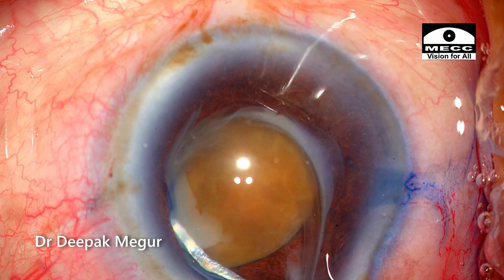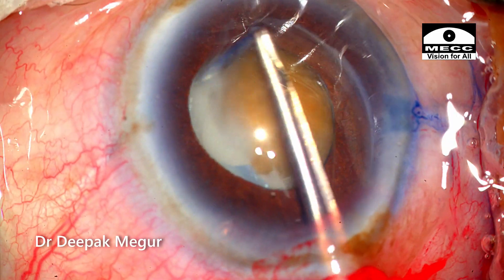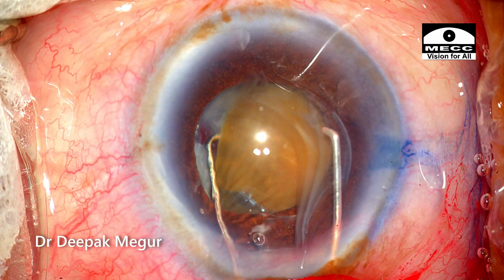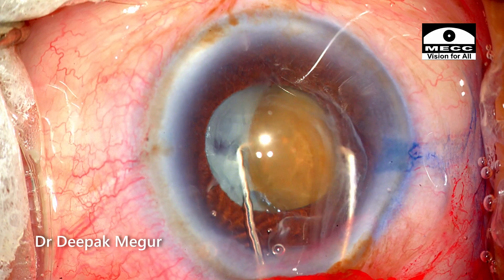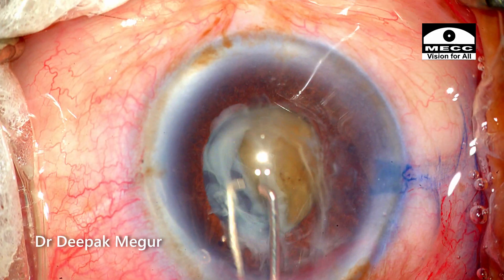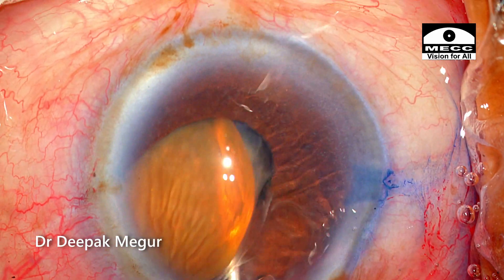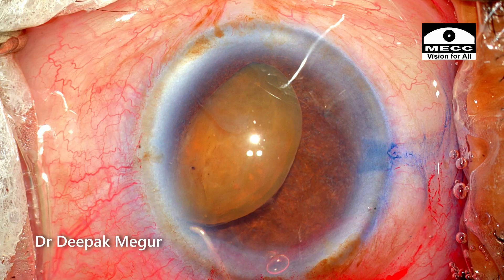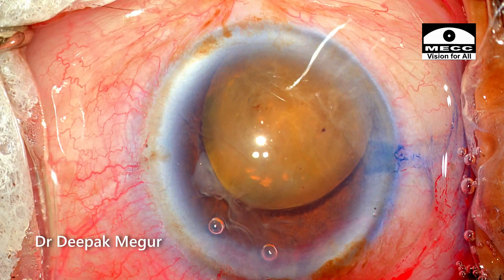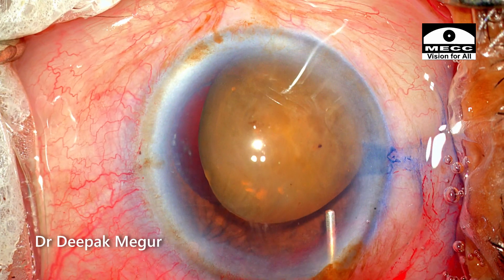The capsular edge is being trimmed now just to make the opening a little more symmetric. As I am manipulating the nucleus out with my two Sinski hooks, it seems to be slipping out and the cortex coming out is worsening the visualization. I go back with the viscoelastic and by injecting it under the nucleus, I can levitate it up and out. It can then be wheeled out into the anterior chamber, although it can be expressed out in a single piece with a slightly larger incision. However, in this case, I am going to use the snare to bisect the nucleus.